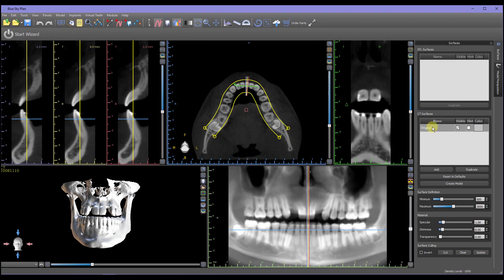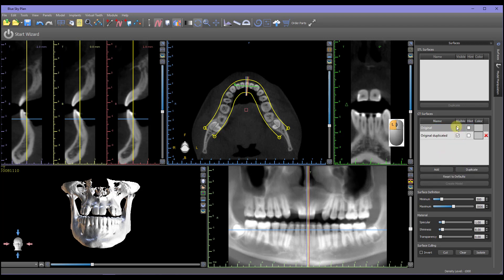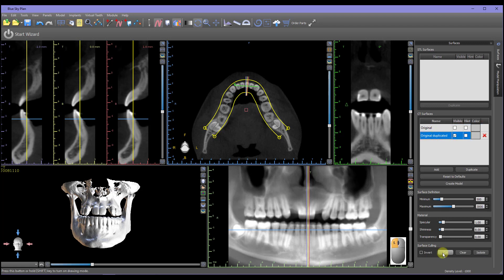In the Surfaces panel, left-click the Surface Name Original, then left-click on the Duplicate button. Left-click to uncheck the visibility on the original line, then left-click on Original Duplicated in order to highlight.